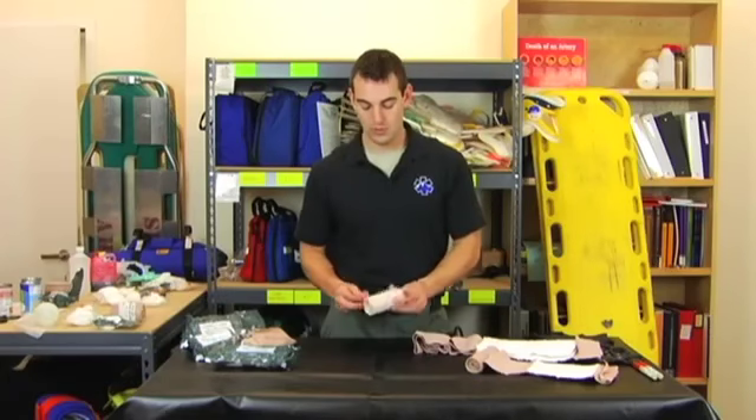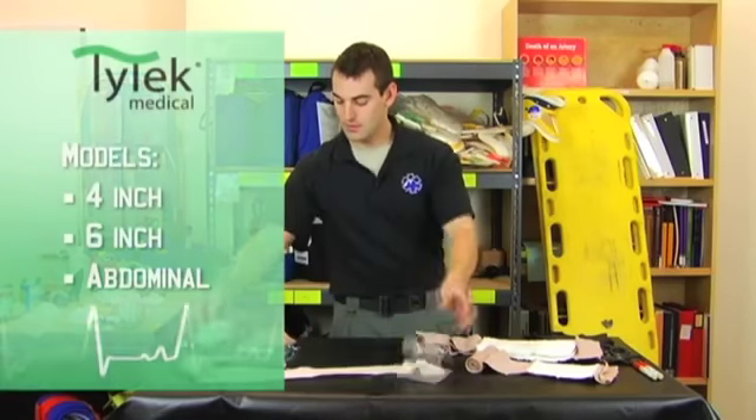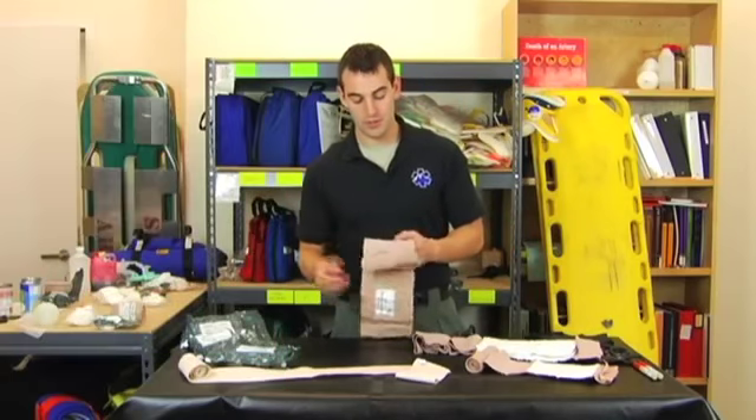Unlike conventional elastic wraps which roll away or become difficult to manage in the field, our design has hook and loop stays throughout the entire length of the bandage, ensuring controllability in all situations.